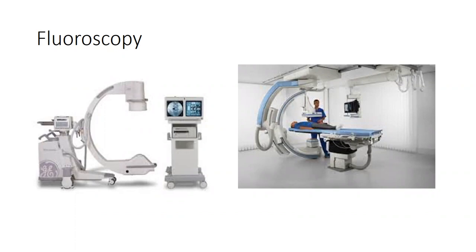Okay. Now there are special CT scanners and in some cases even MRI scanners, but a lot of special procedures when you hear that interventional radiology is getting done with the C-arm. And this is the workhorse in orthopedics. Okay. As you can imagine, a lot of the techniques that we use to fix fractures, especially when we try to avoid opening up the entire bone, because when you strip all the soft tissues off of the bone, you take away the periosteum and the blood supply that's critical to healing. Okay. And so using fluoroscopy, we can use minimally invasive techniques to visualize where there is bone, where there is metal, and how they relate to one another, and safely apply a device without stripping away all the biological substrate that's going to help that heal.